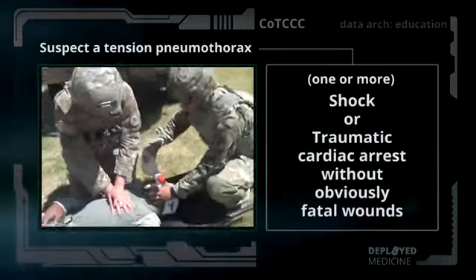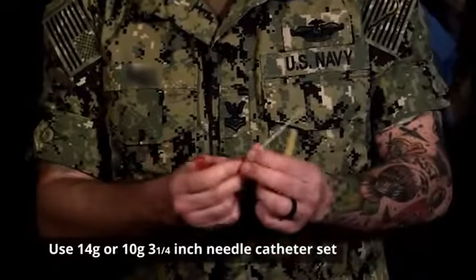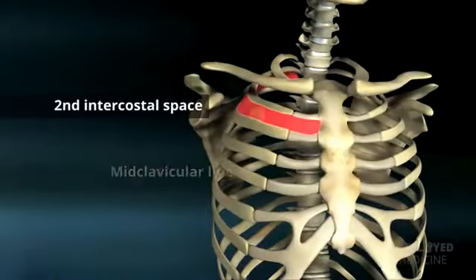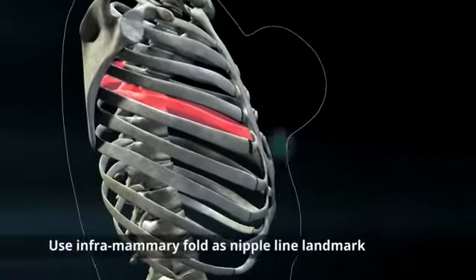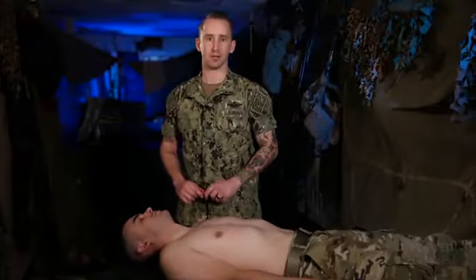without obviously fatal wounds. The needle chest decompression is performed using a 14 or 10 gauge 3 1/4 inch needle catheter. There are two acceptable sites for the needle chest decompression: the 5th intercostal space on the anterior axillary line or the 2nd intercostal space at the midclavicular line. The nipple level is variable in females, but you can lift the breast and use the level of the inframammary fold. I'm going to demonstrate on the 2nd intercostal space, midclavicular line.